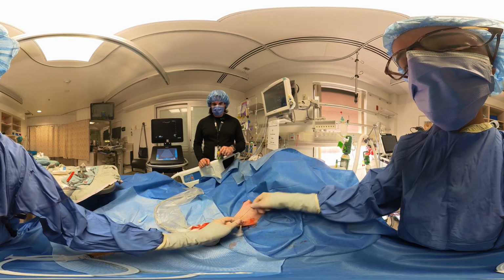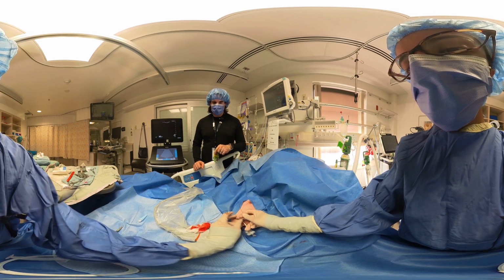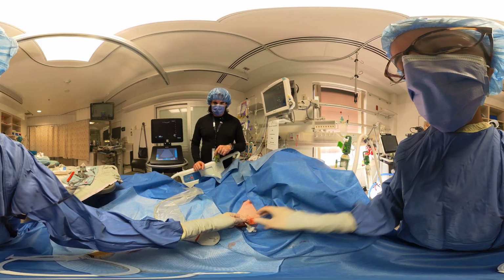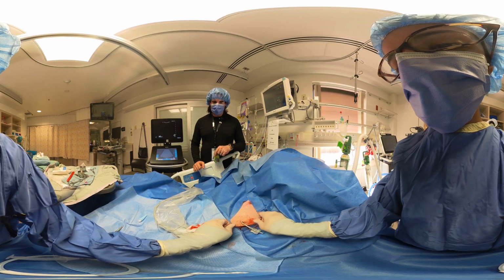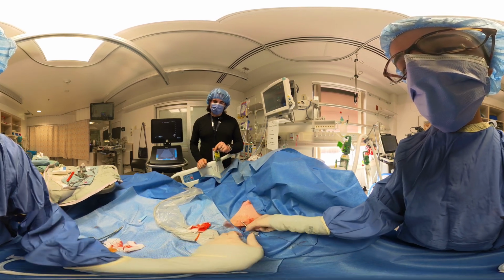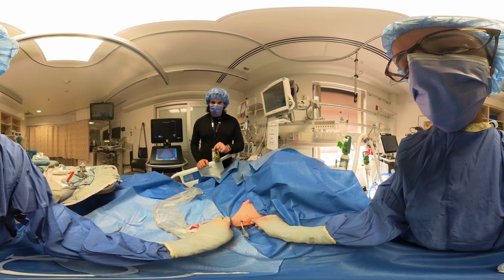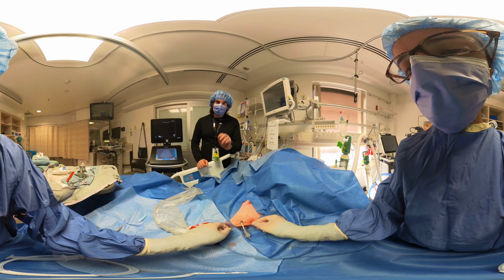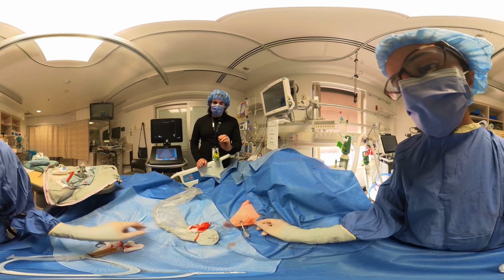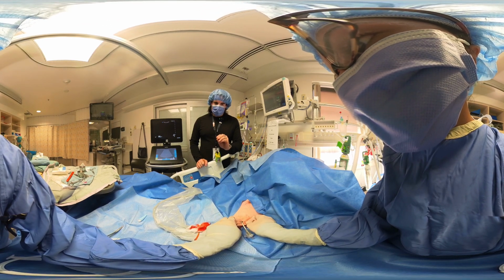How do you usually hand tie? You can just tie a regular knot. Yeah, that's fine. And so one cinch, what'll happen is not too hard. Okay. Now push it all down to the bottom near the skin. Okay. Good. Now pull it tight again. Okay. Now you want it tight enough so it very, very slightly indents the tube, but not enough to occlude it. Does that make sense? Okay. Yeah, like that. It's perfect.